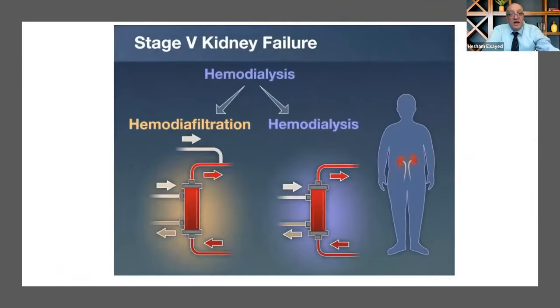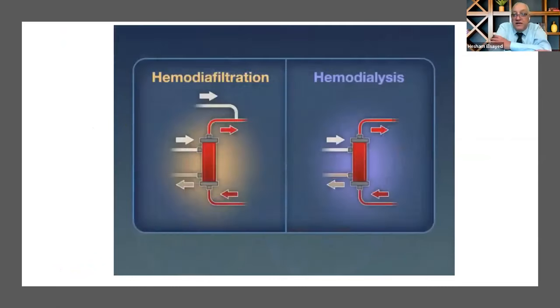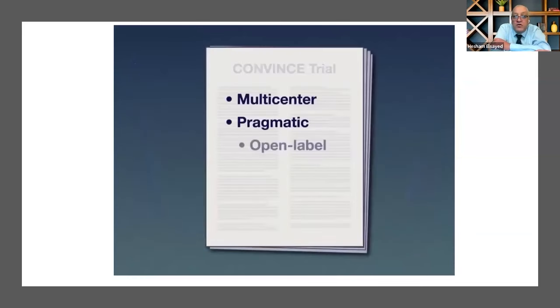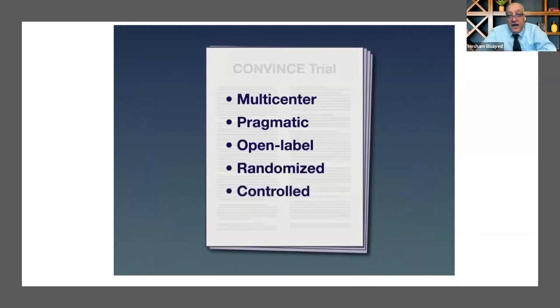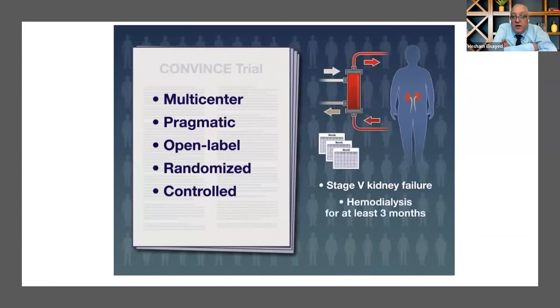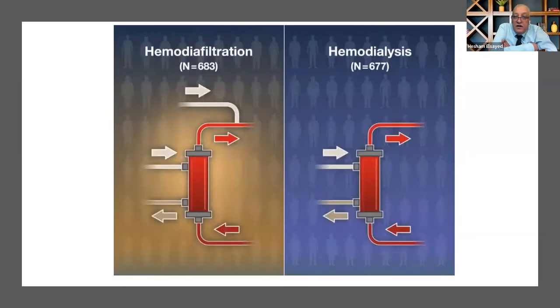It was a pragmatic study controlling hemodiafiltration against hemodialysis, extending for 3 years, with hemodiafiltration ensuring the convection volume is above 23 liters. All-cause mortality was improved, but not cardiovascular death. Probably a lot of patients died with COVID, but on discussion with Canaud, they say that they cannot differentiate between cardiovascular death and COVID death during the pandemic.